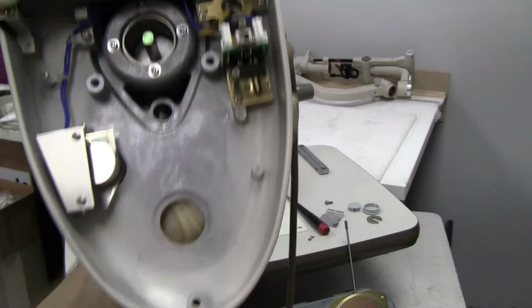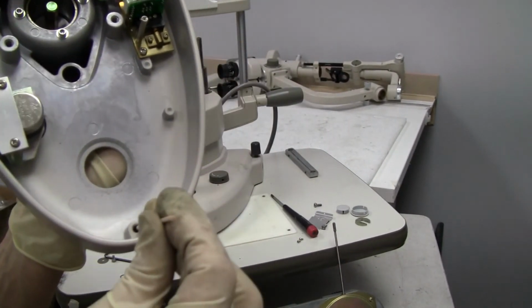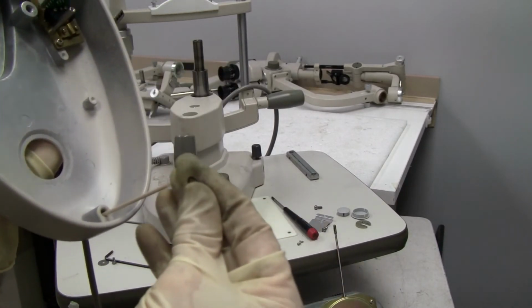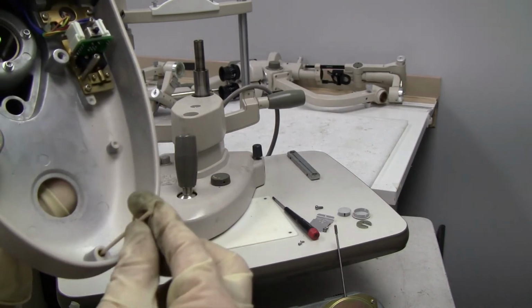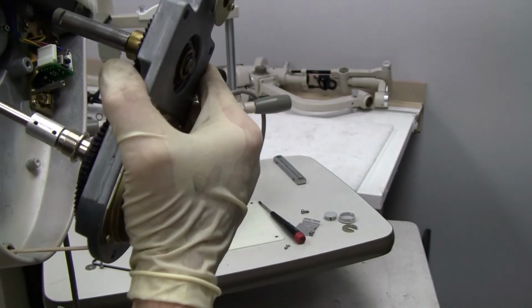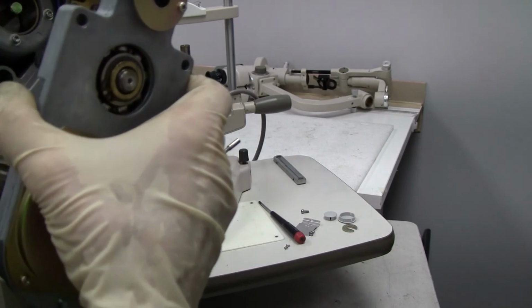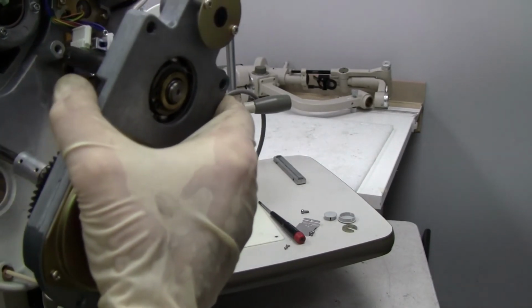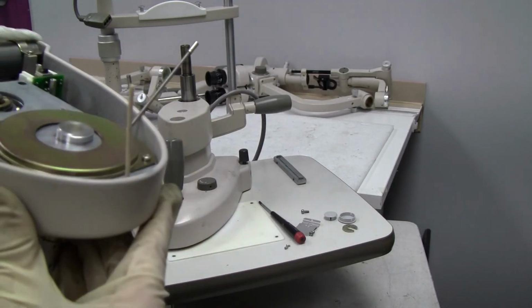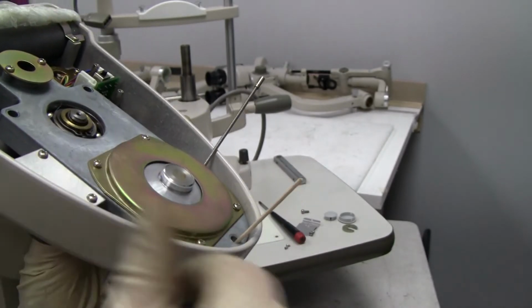When it comes time to putting it back on, one way I've learned to put that little washer in is to put some kind of little stick, put my washer in there so that it stays in place. I line up that little stick to make sure I get that right. The little stick is still in place, so I know my washer's still in there. And then I put my bolt back in. That's when I'm putting it back together.